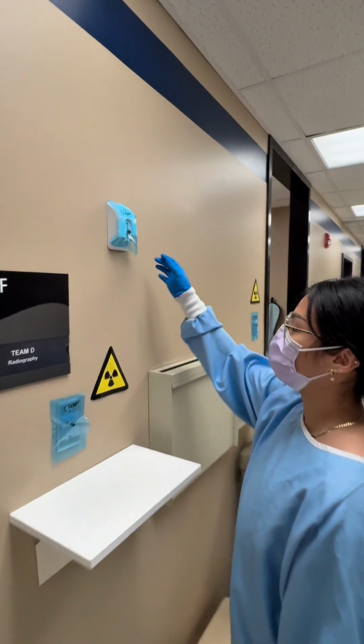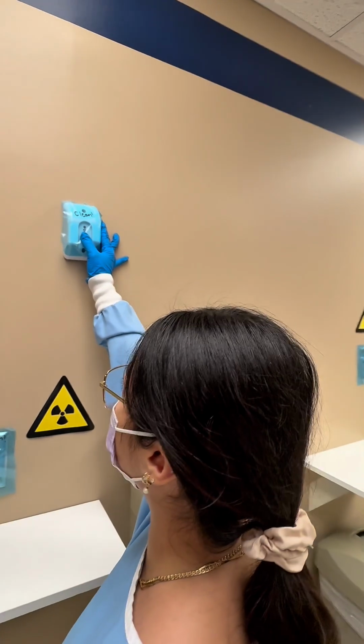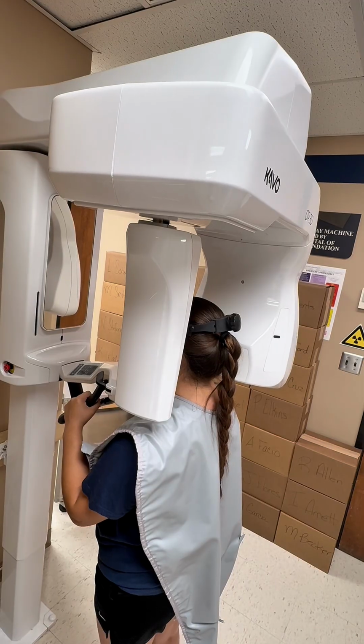Locate the button on the wall outside of room F. Hold the button down until the exposure is completed and you hear a chime. Here is an example of what you should hear. Make sure you are watching your patient and talking them through the procedure.